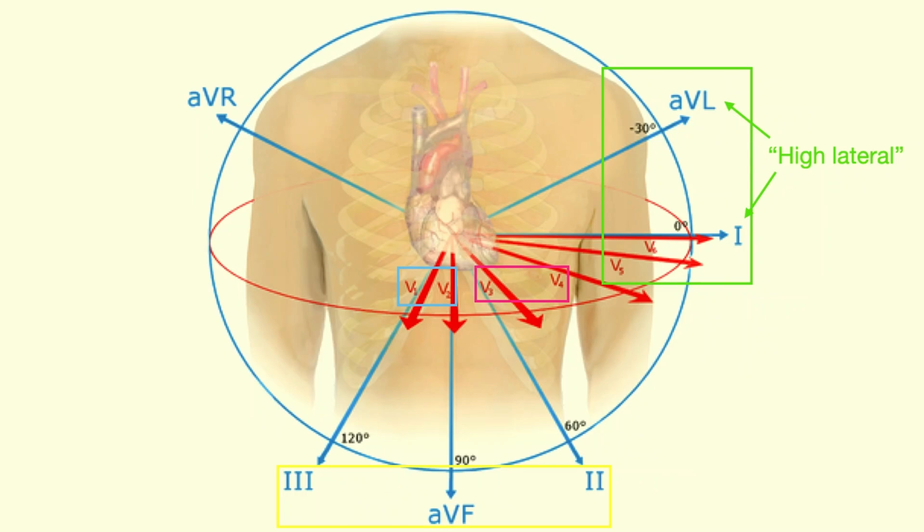Does that make sense? When we have positive deflections in a given lead, that means that the current is traveling toward the positive terminal of that lead.